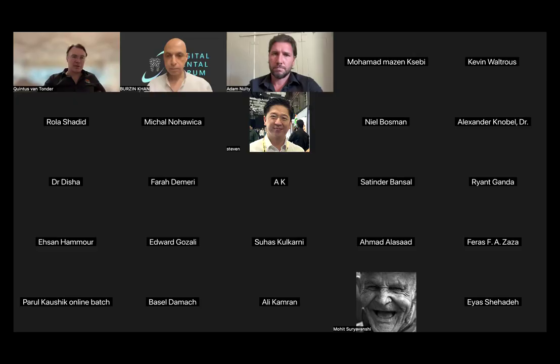So from data collection, I basically do a mock-up, and that we 3D print, depending on how difficult the case is. If you think about it, you'll get your best results from patients that have got the best alignments. And if there are rotations and things like that in the teeth, the gingival architecture is not going to be great.